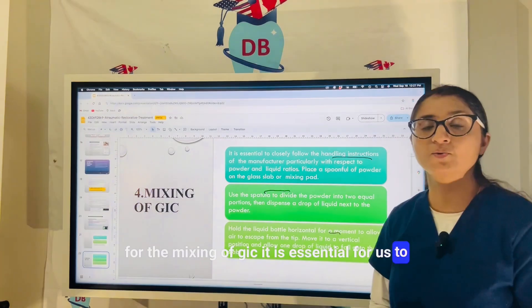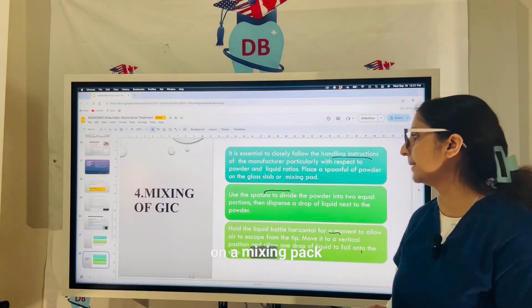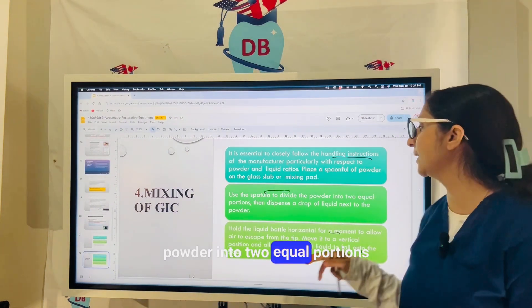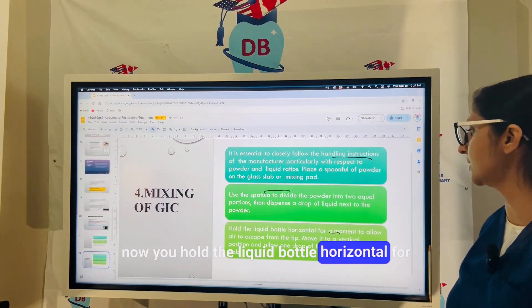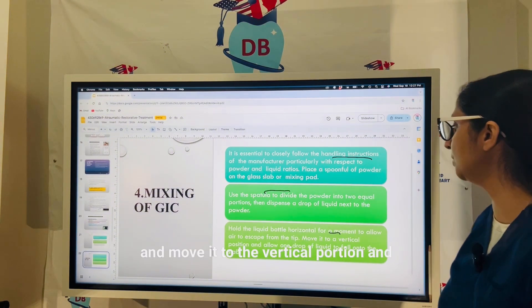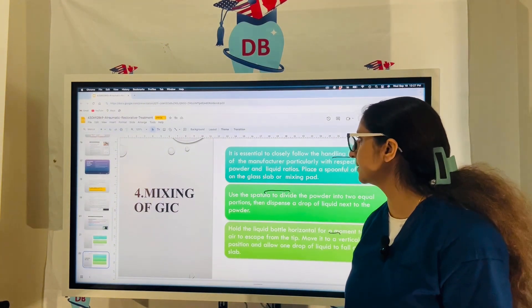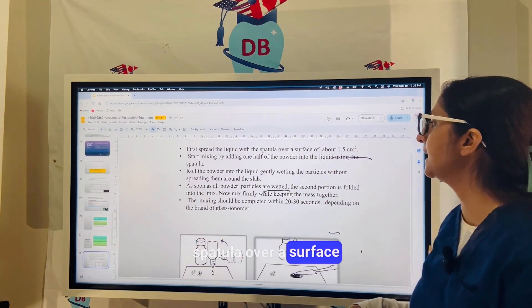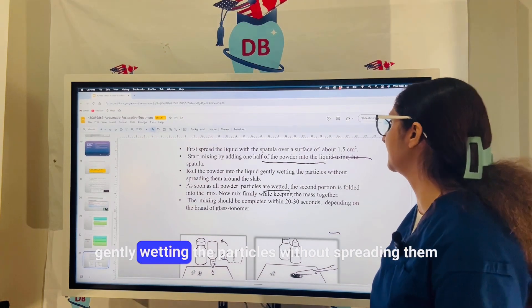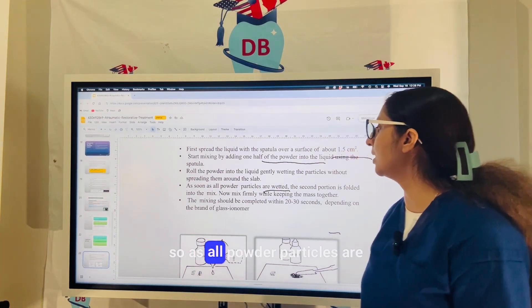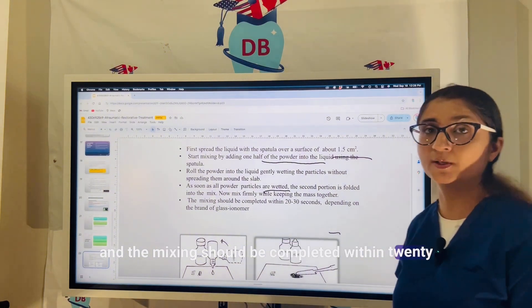When mixing GIC, follow the manufacturer's instructions carefully. Place a spoonful of powder on a mixing pad and divide it into two equal portions using a spatula. Put a drop of liquid next to — not on — the powder. Hold the liquid bottle horizontal to allow air to escape from the tip, then move it to the vertical position and allow one drop to fall onto the slab. Spread the liquid with the spatula, then add the first half of powder into the liquid, rolling the powder in gently. Add the second portion, and complete mixing within 20 to 30 seconds.